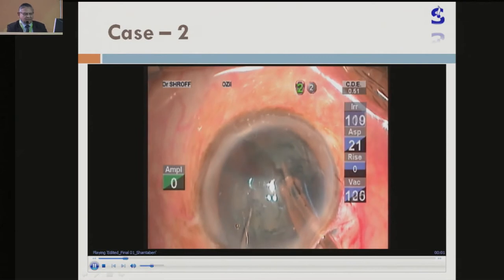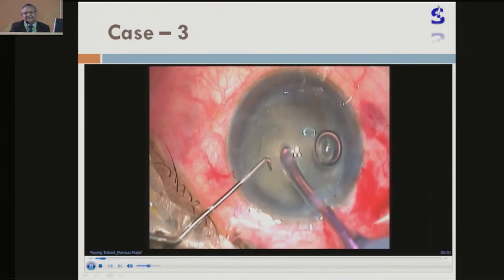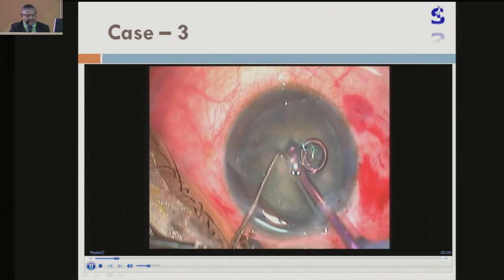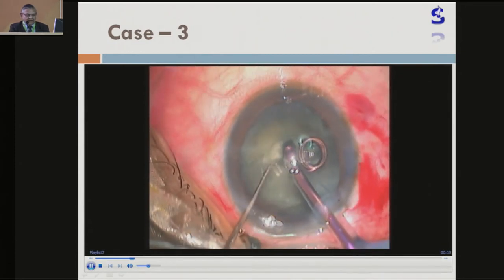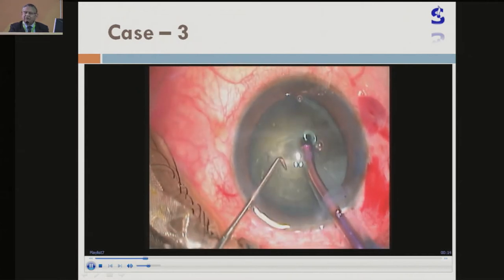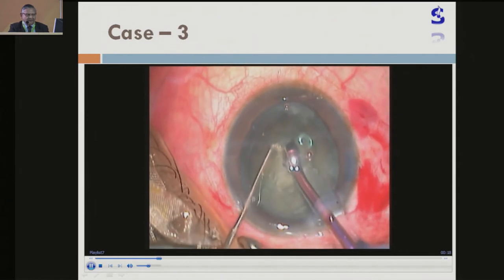Here I have used the Stellaris PC with the Venturi system — again very high vacuum, 450. And you can see that the nucleus has been grasped. Sometimes it doesn't engage because the vacuum is lost somewhere due to foot switch issues. But then once it is engaged, you can chop it.